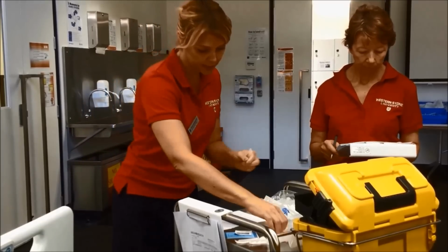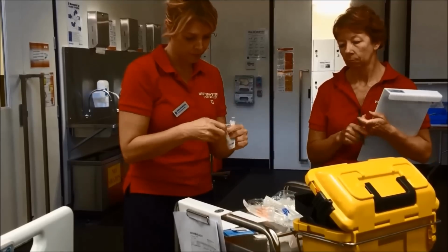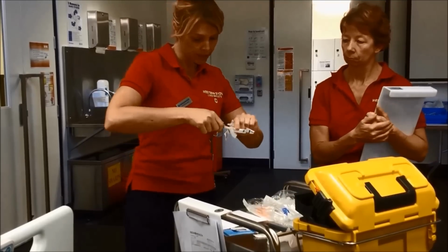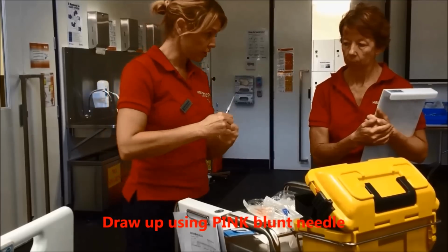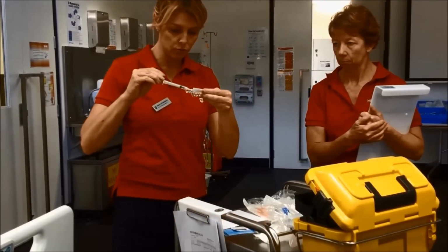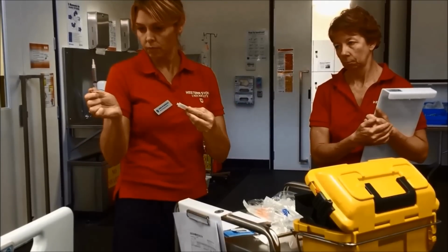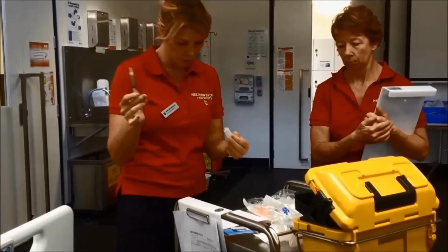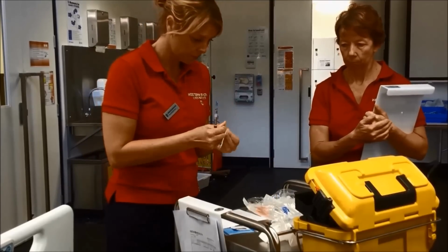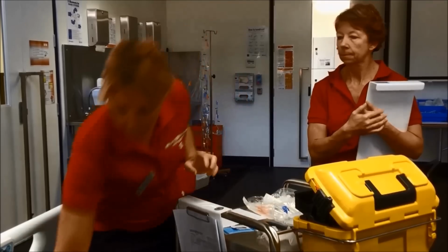Okay, so gentamicin. I'm going to draw it up using this pink needle, and then I'm going to put a second pink needle on it, just while I prime it on. Because we can't recap needles. 2 mils, beautiful. Taking that off, to keep it aseptic. Okie doke.